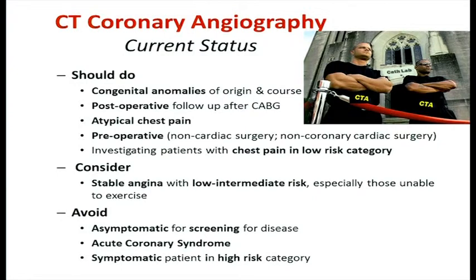Thank you. Thank you for giving a very, very excellent review of CT angio, removing some of our doubts. The problem occurs, although you have clarified it, we get patients of diabetes, hypertension, who have got a premature family history of CAD or something, many other factors, and they want us to exclude coronary artery disease. So now what we do is a stress echocardiogram. Now stress echo has got its own limitations. So the subset which you mentioned, diabetes, there are risk factors, there is a family history. You can send the patient for a coronary calcium score.